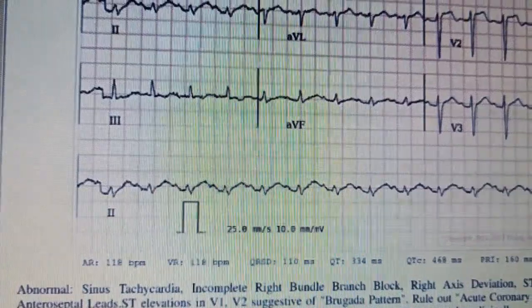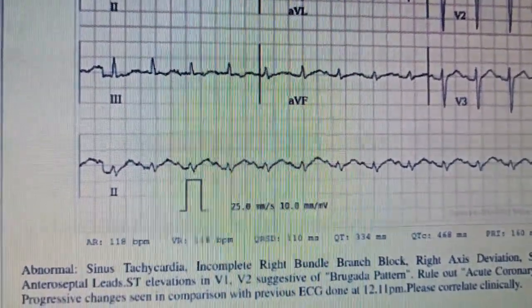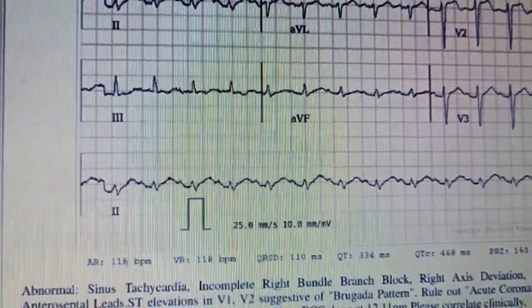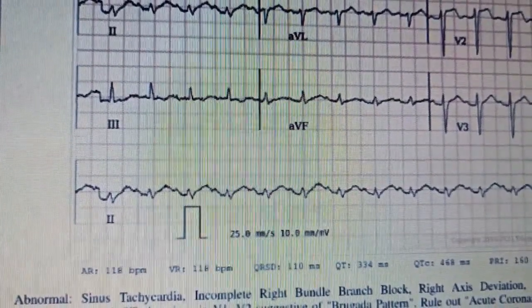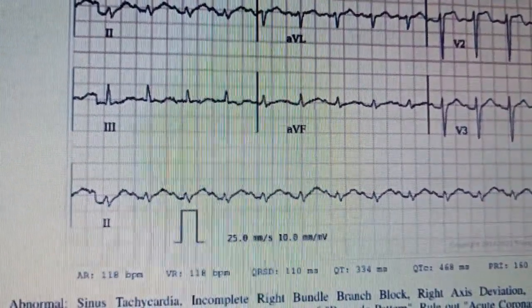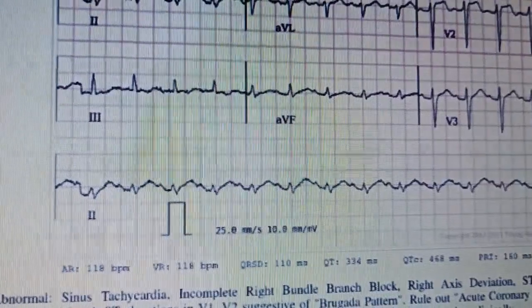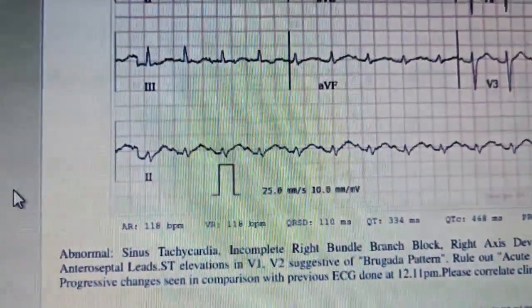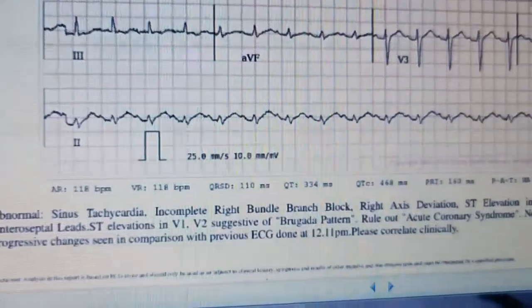It is the normal pattern of the heart to beat at the same rate in the same pattern under the influence of the same pacemaker. Now there are certain conditions where you will find the atria and ventricle both beat independently. For example, in the case of third degree block, where AV dissociation takes place and the atria beat under the influence of the sinus pacemaker, and that is normally 80, while the ventricle beats under the influence of the ventricular pacemaker, that is 40. And likewise here I want to say that there must be certain difference, so AR and VR have been quoted here.